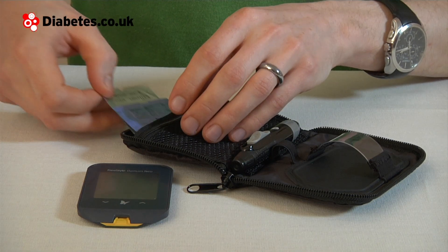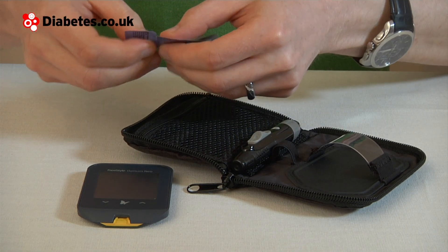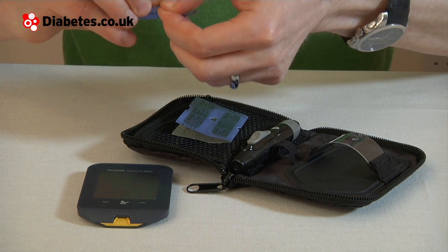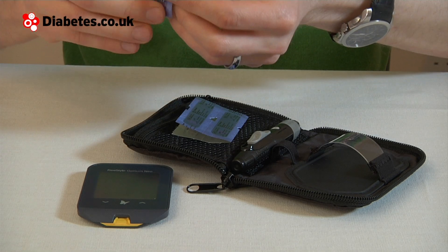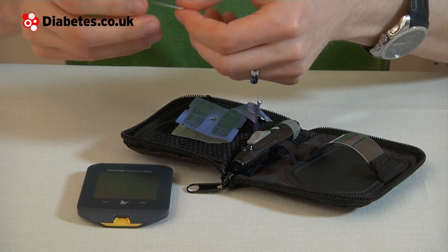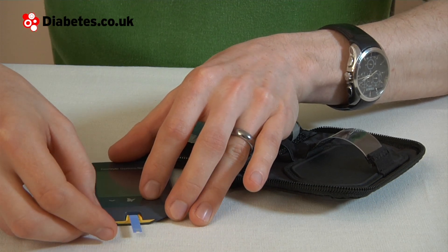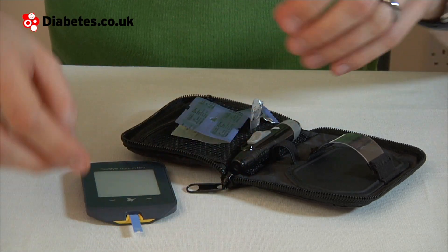Now let's run through a test. Start by taking a test strip outside of the foil — the foil wrapping gives them more freshness. Stick it into the test strip port here and the meter turns on.